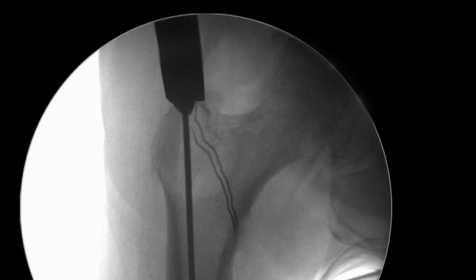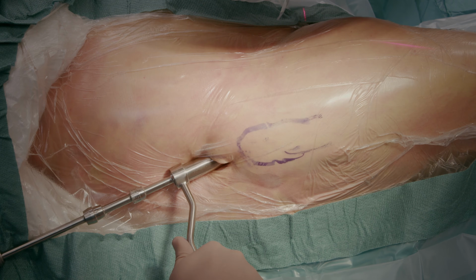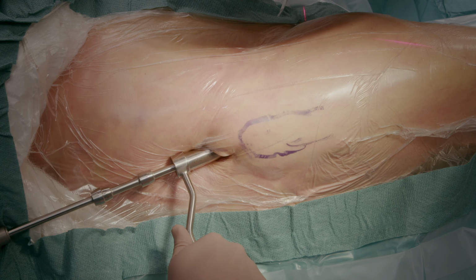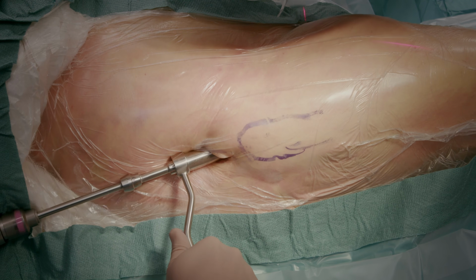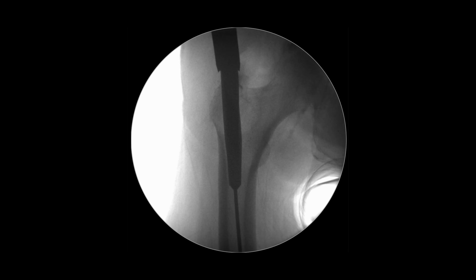With the reamer, the idea is to drill a tunnel in the bone for the nail. Due to the protective reamer sleeve, the reamer stops moving forward automatically when it has reached the maximum required depth. Therefore, the protective reamer sleeve tip must be properly against the tip of the trochanter. We have now reached the maximum depth with the reamer.